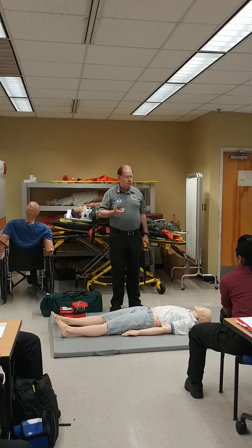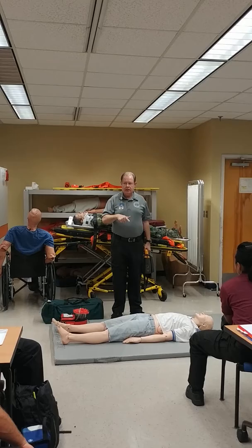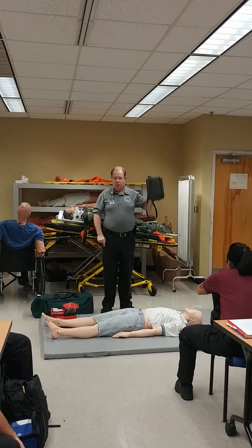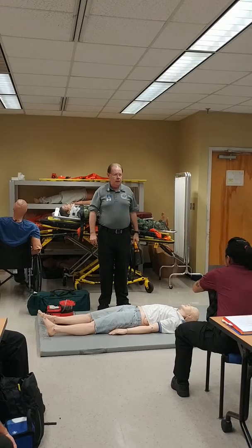The third person connects to oxygen. Actually, we're going to turn on the AED first, because oxygen isn't going to bring them back. What's the only thing that brings back patients in cardiac arrest? CPR and the AED. So basically, we're going to pump and we need to make sure we are radically pumping and ventilating our patients.